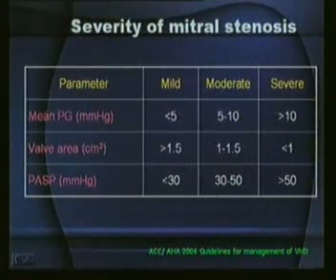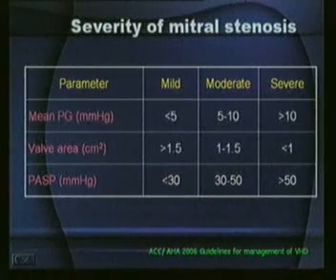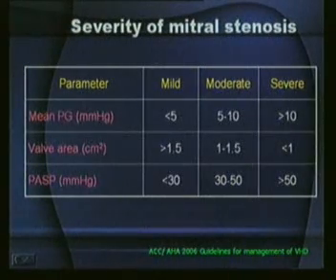Mind you, echocardiography is one of those investigations used on a day-to-day basis for follow-up of patients, because the first time the patient comes to you, his mean pressure may be less than 5, he is mild. So leave him alone, just give him penicillin injections, or whatever else, digoxin, whatever he requires. The minute he goes from mild to moderate, you have to start thinking. So what is the criteria?